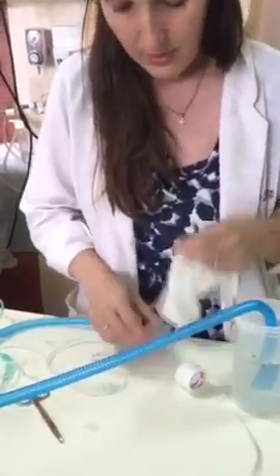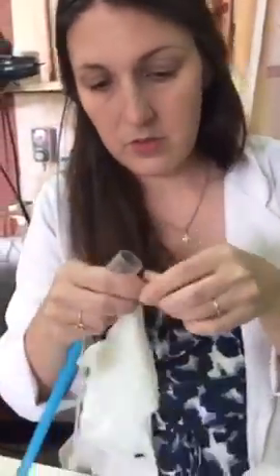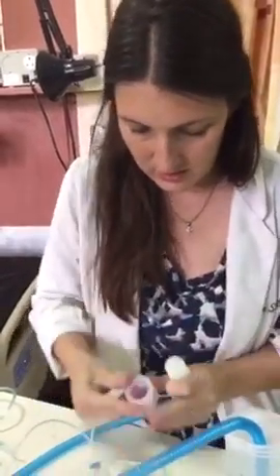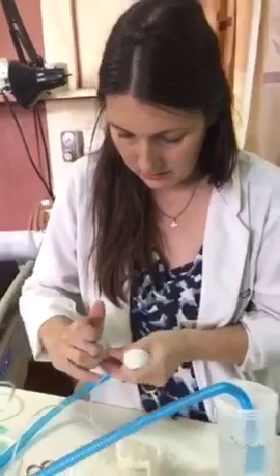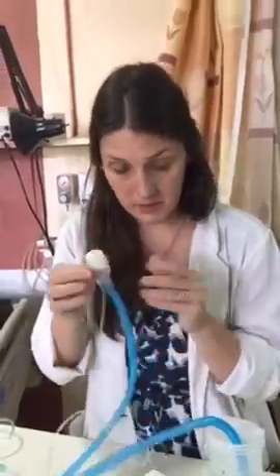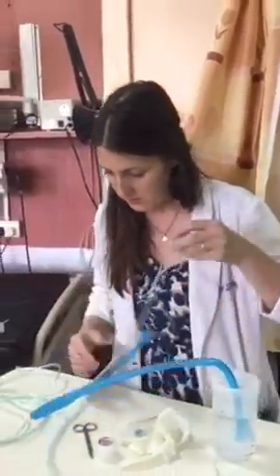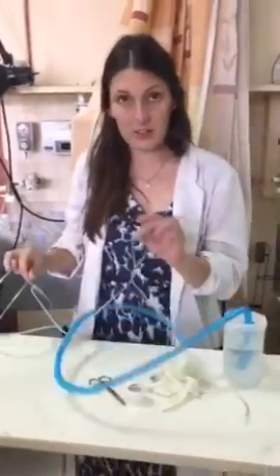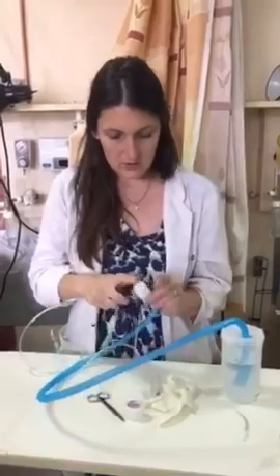The final step is we have to seal this part right here. What we decided works really well is a glove. Take the glove, tear it off or cut it, and put it over the end here. Wrap another piece of tape. So: knot here, seal here, seal here, oxygen here, tubing under the water.